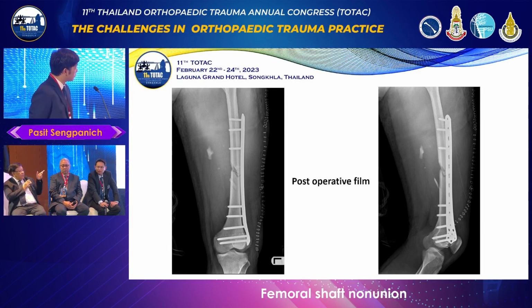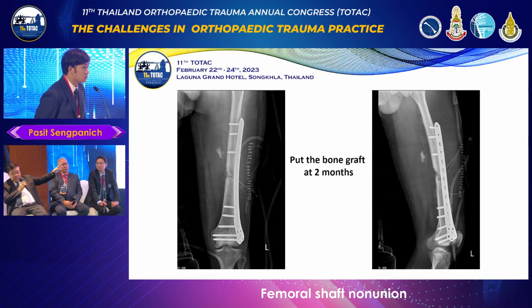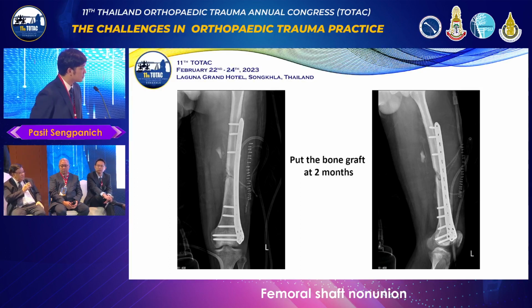And you also do a bone graft, right, when you present? You do some bone graft. This is a bone graft. Yeah. If I have to do this, I may be right or wrong, I put more screws. I will not just put only bone graft, because if you have instability and you put the bone graft, the graft will be resorbed. And in this case, one of the reasons that you have to find is to put maybe just 2 more screws, and hopefully, if there is no infection, of course, that is what we have to find out, it may unite.